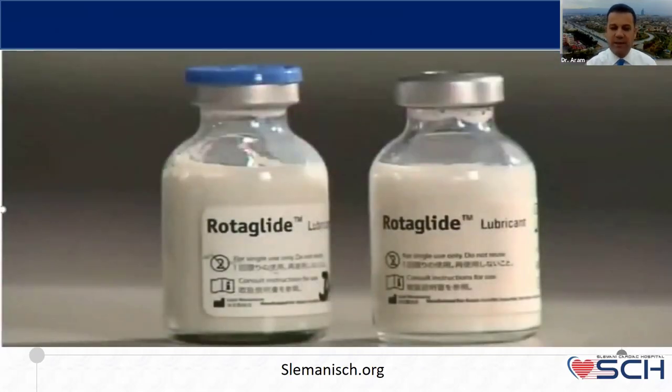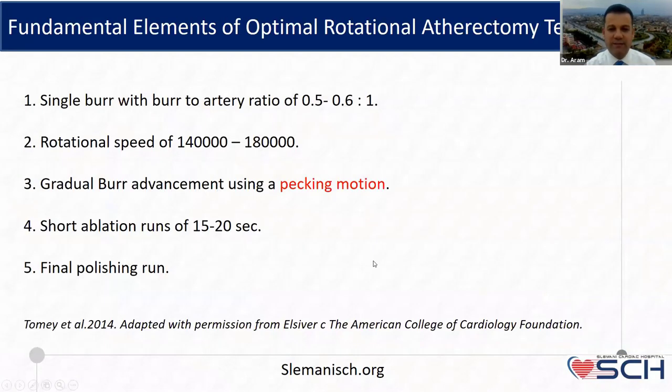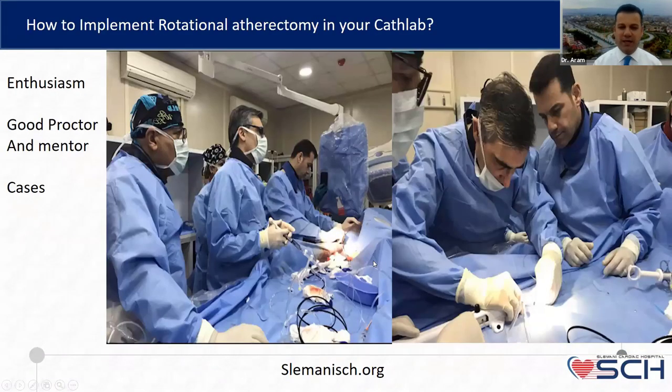Thankfully, he came and we did several cases. And actually, he is a fantastic proctor and mentor. And you should have good cases. Please select the cases. To start with the rotablator in a cath lab, you should select cases, not bring difficult cases that are very calcified.